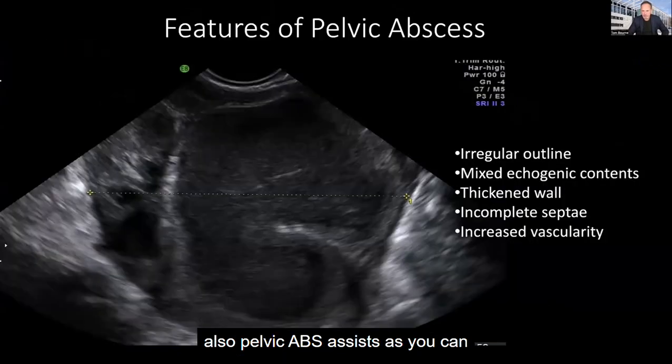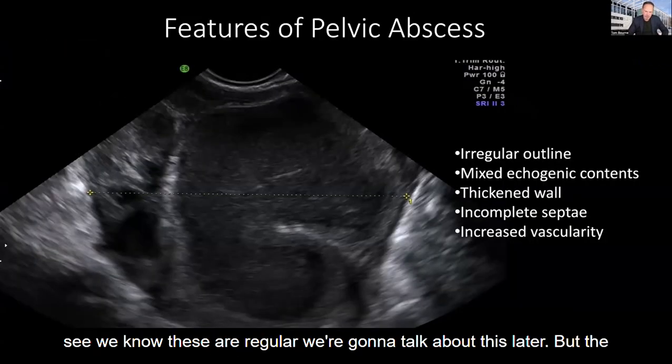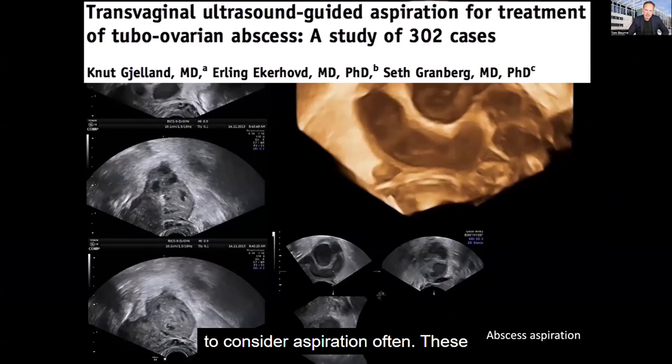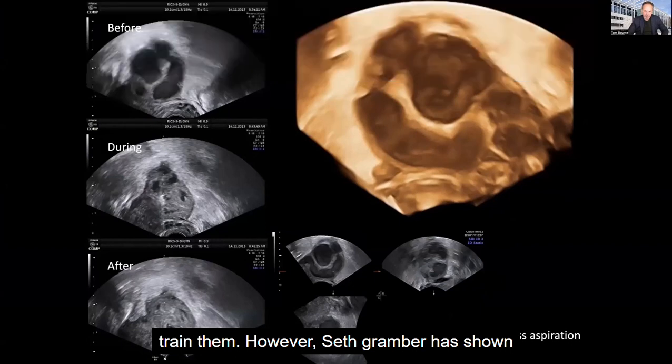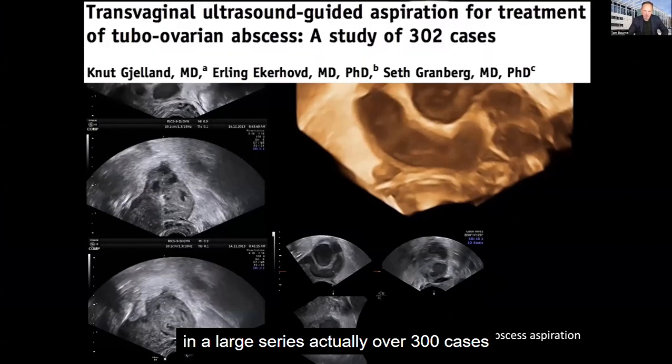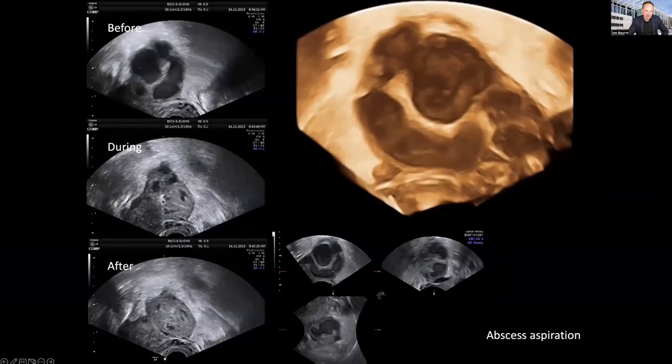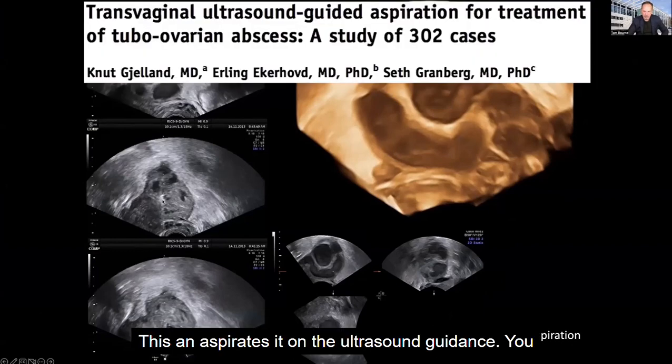And also pelvic abscesses. As you can see, we know these are irregular. We're going to talk about this later, but the reason I wanted to include abscesses is just a plea to consider aspiration. Often these are difficult to manage surgically if you need to drain them. However, Seth Granberg has shown in a large series, actually of over 300 cases some years ago now, and you can see here how a needle has been put into the abscess and aspirated under ultrasound guidance.